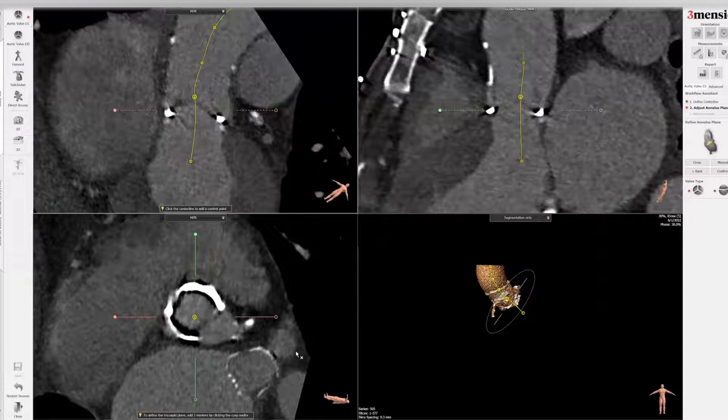Hello, today I'm going to show you the Mitroflow workout for valve-in-valve TAVR. This is one of the more common surgical valves that you might see coming back with degeneration requiring a valve-in-valve TAVR workup.